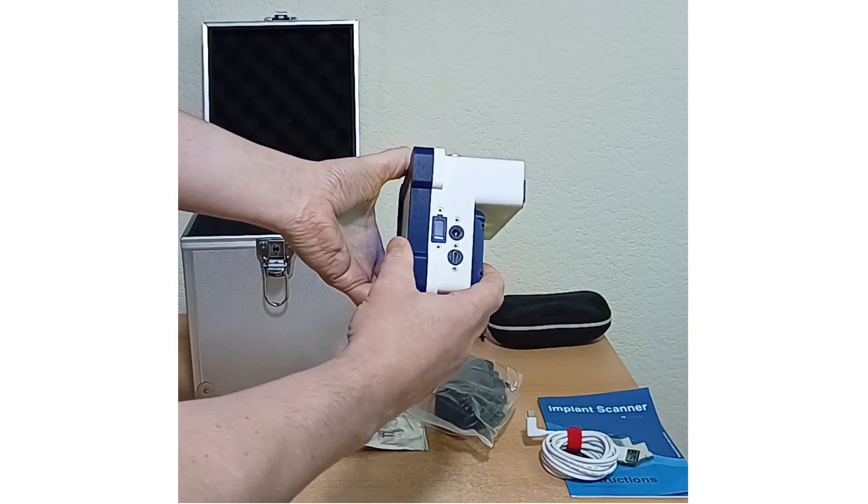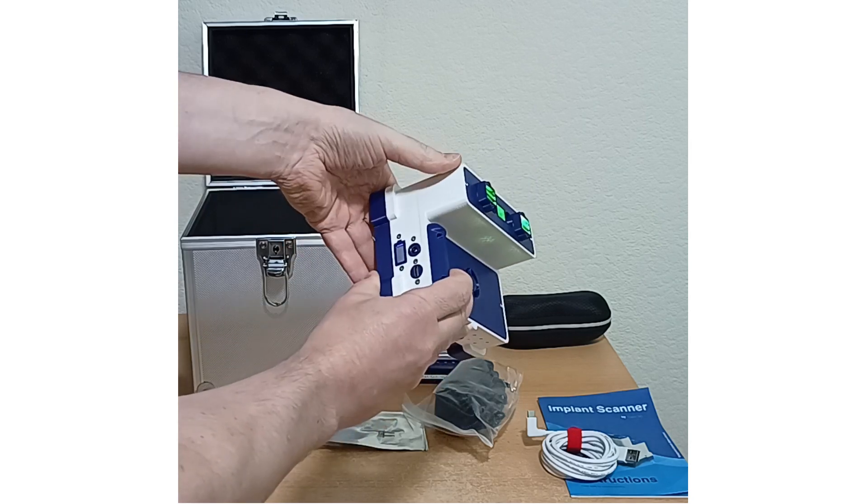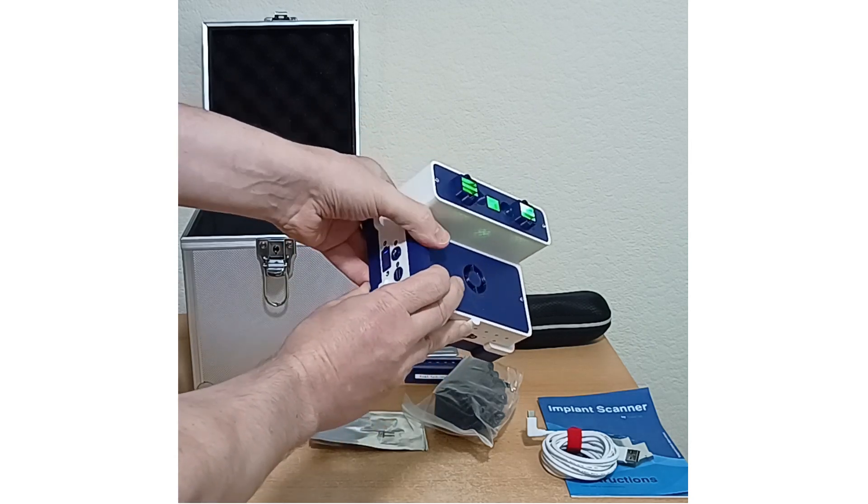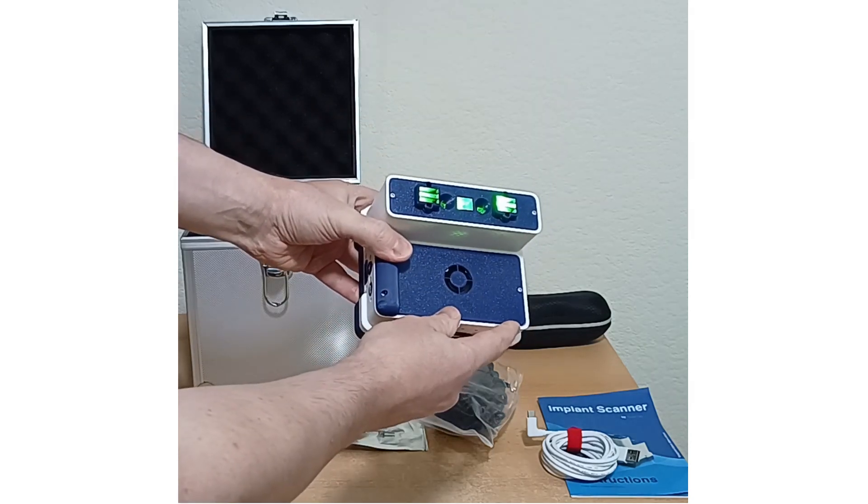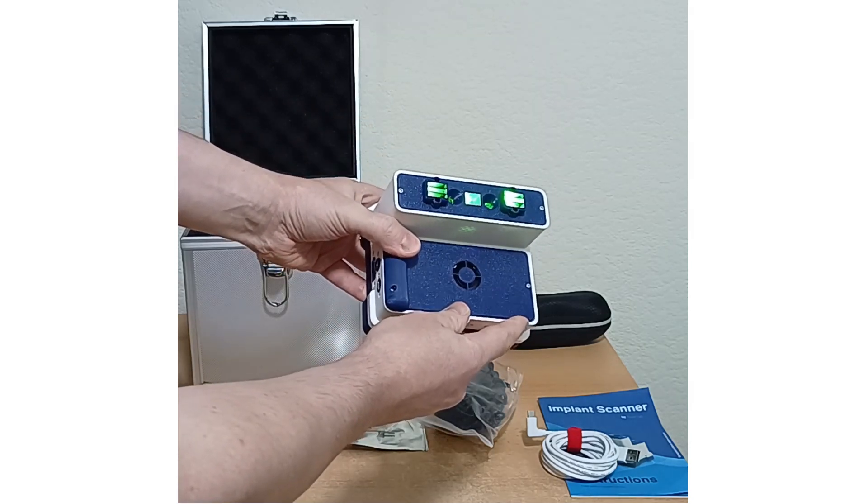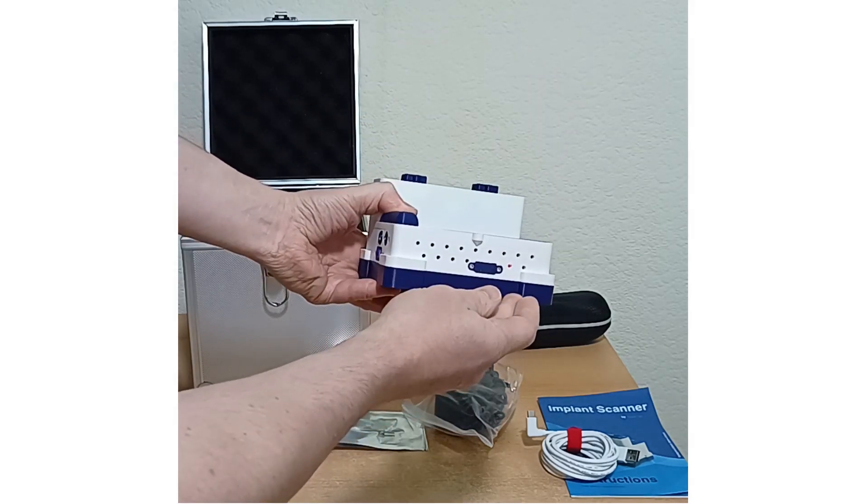On the side we have the battery power level meter, charger input, and USB. At the front of the unit there's the twin cameras and green illumination.